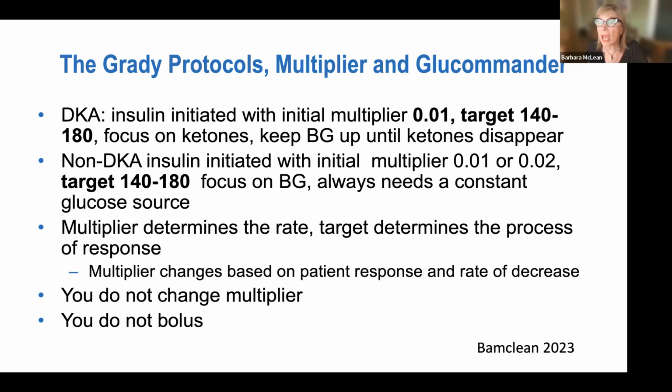It's not where you're going to stay. That multiplier is going to change consistently with the way the patient is responding to insulin. Our target will be 140 to 180, but here we're going to focus on the blood glucose.